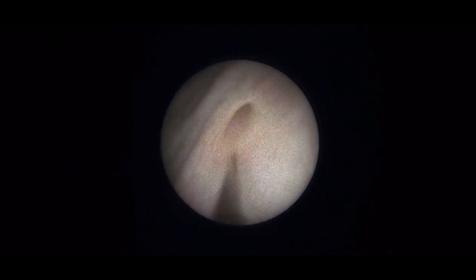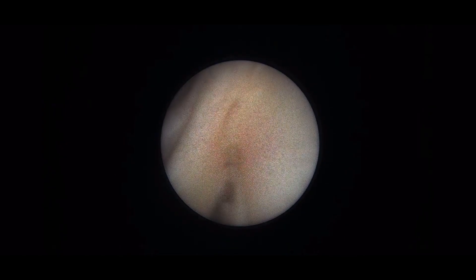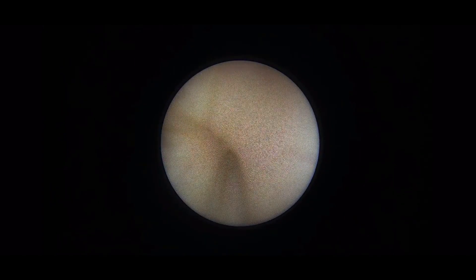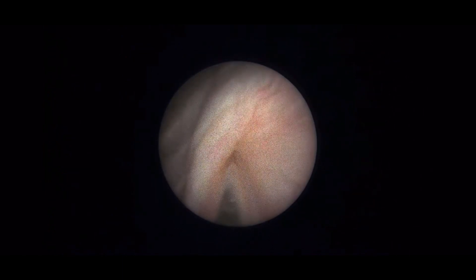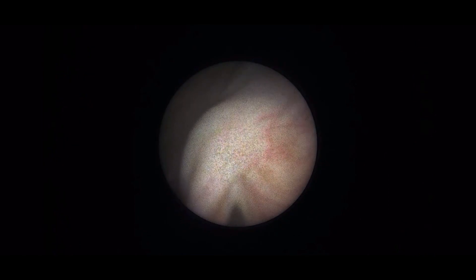Here the left-side urinary orifice is found to be patulous, and as you can see there are two marks on the needle — there is a circular mark and there is a square mark.